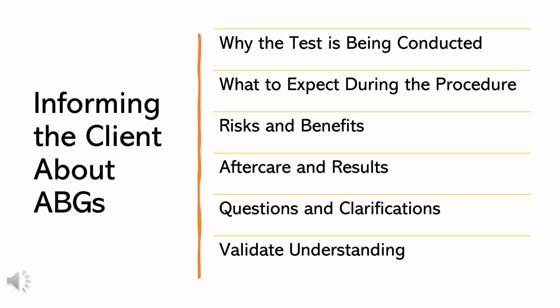Clearly articulate the medical necessity for an ABG test, be it to assess oxygen and carbon dioxide levels, acid base balance, or any other critical clinical indicators. Inform the client that they may feel a sharp momentary sting during the arterial puncture. Reassure them that this discomfort is typically brief. Explain that the entire process usually only takes a few minutes, from preparation to completion.